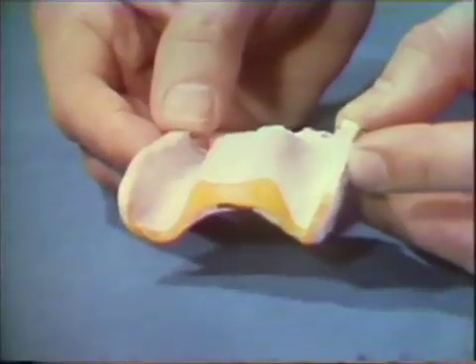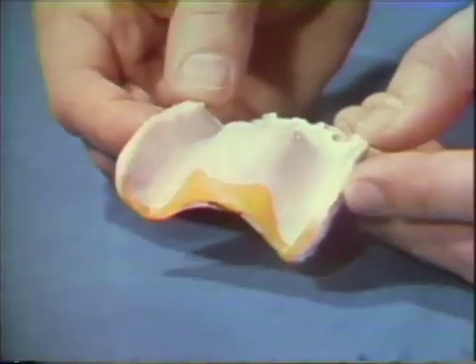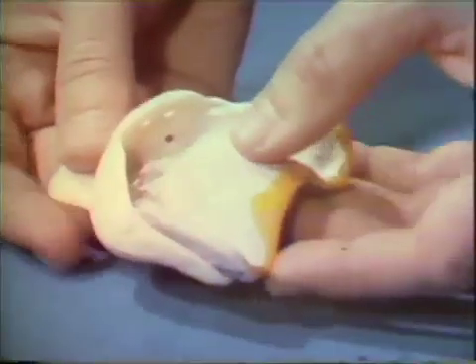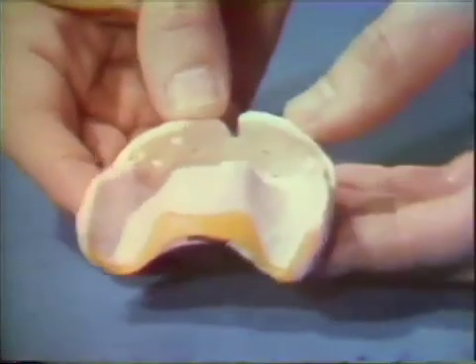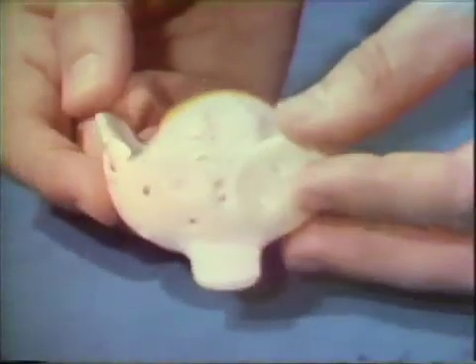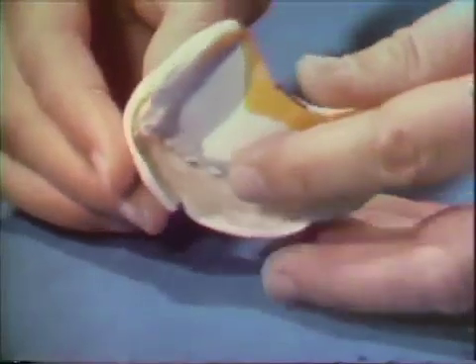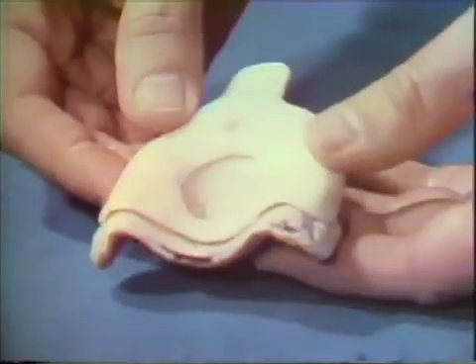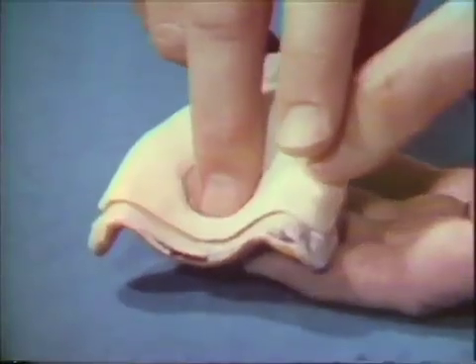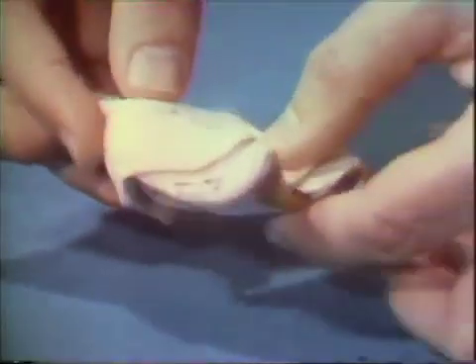The secondary impression material is distributed evenly over the tissue surface and the post-palatal seal affected. Any excess zinc oxide paste is removed from the anterior portion of the impression to permit the second tray to fit the posterior portion exactly. This sequence shows the assembly of the dual trays before placing them into the mouth. They join snugly. The posterior borders have been fully developed in this first part of the impression.